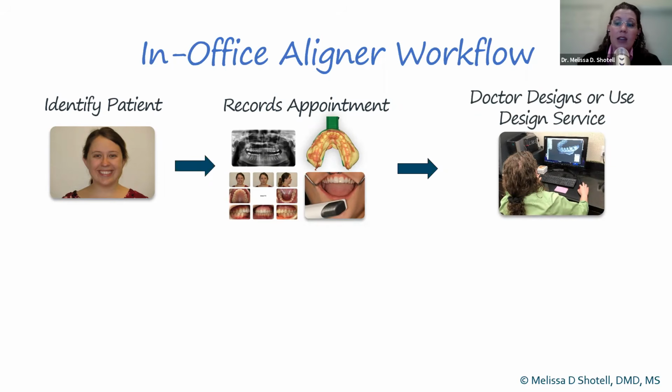If you're not ready to take a step into designing your own clear aligners, we can have Michael speak at the end about some of the services through Lab Pronto and Blue Sky Bio. There are services available to have that setup created for you.